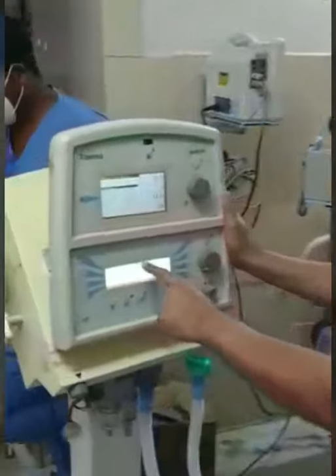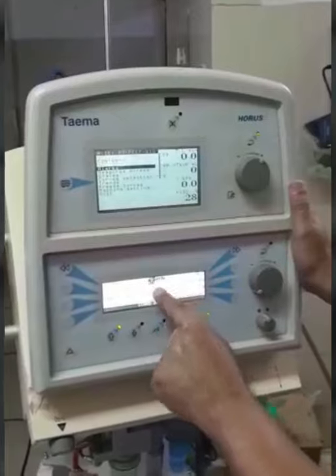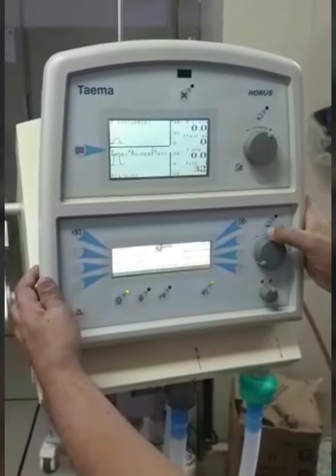In the machine, we go for PS PEEP NIV mode. We can go for regular mode also, but non-invasive is preferred. We can use straight away PS PEEP also — PS PEEP NIV — and then switch on the machine.